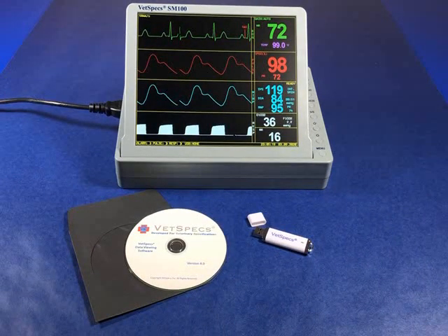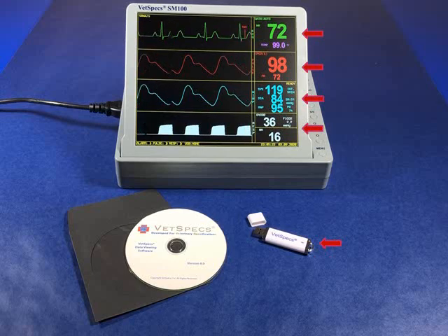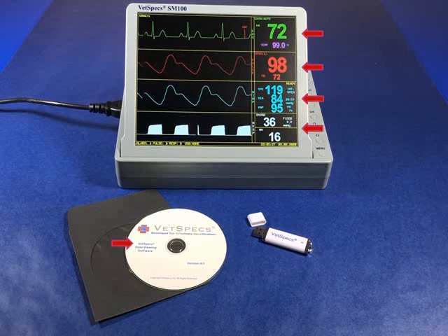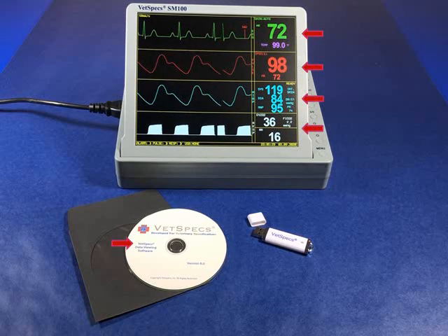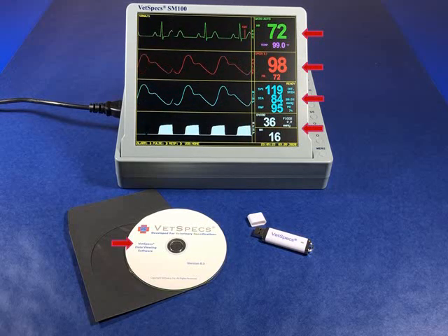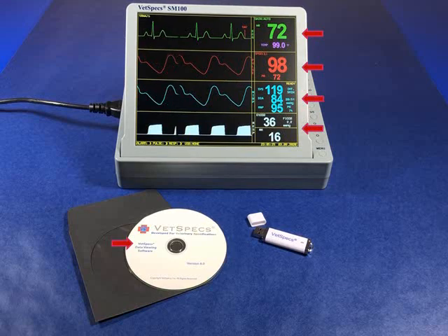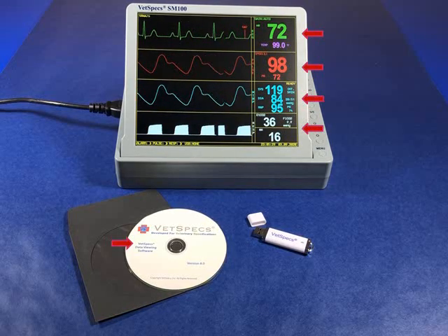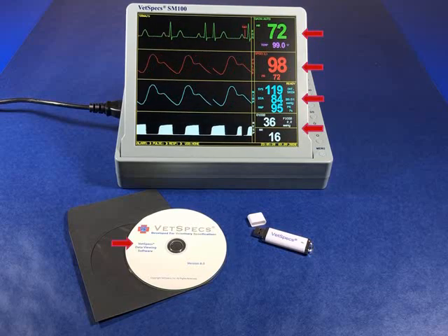The SM100 comes standard with our latest digital data saving capability. This helpful feature allows all waveforms, trends, and charts to be saved to a flash drive which connects to a USB port conveniently located on the side of the monitor. VetSpecs provides an easy-to-use data viewing program which may be loaded on any Windows-based computer. Once installed, the viewer allows the user to enter notes, review saved data on a micro or macro scale, create 8.5 x 11 printouts, and attach saved data to their practice management software.